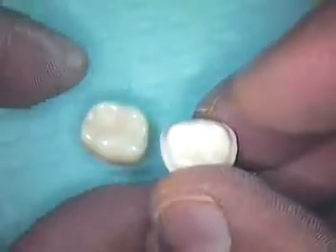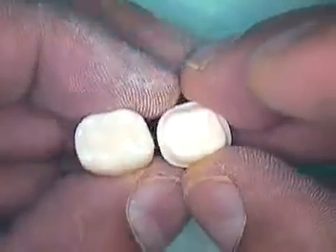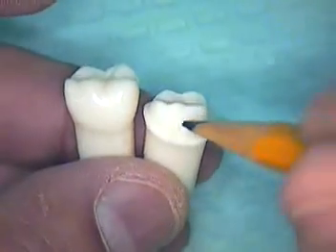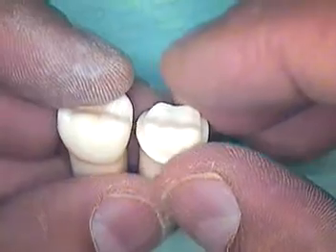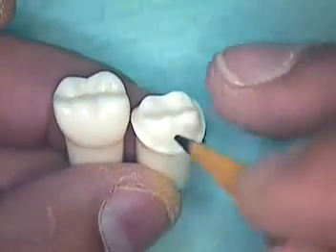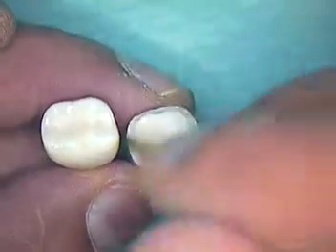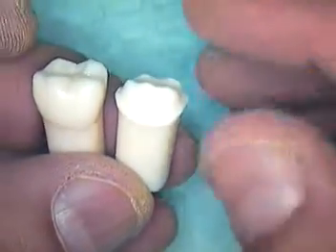If we look straight down at our tooth preparation and compare it with that of the unprepped tooth, we can see there's a huge diameter difference. We want to substitute what's missing now — plastic or porcelain — to make the final permanent crown. Distribution of forces is important so that we have an even thickness throughout, tapered near the margin of course.